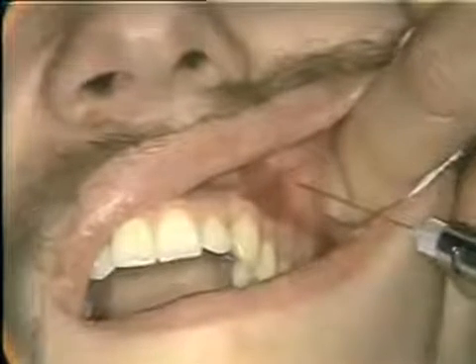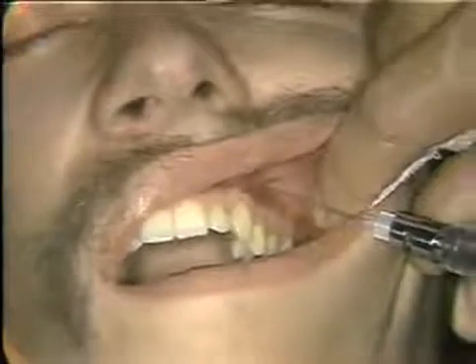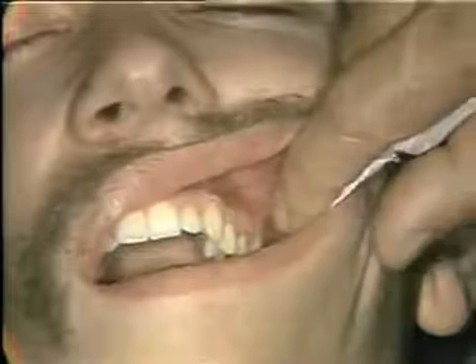Now you can observe again the tight, tense vestibular tissues, and our needle can be very easily passed through them. In fact, on occasion, sometimes you can bring the lip down and actually pull the vestibular tissues over the needle bevel as you make the penetration. And then needle bevel carried quickly to bone. We aspirate and inject a cc.5 to a cc.75 of solution, and then out quickly.